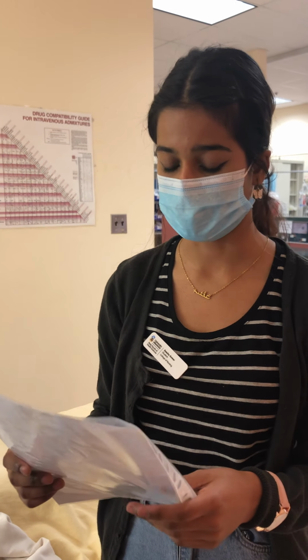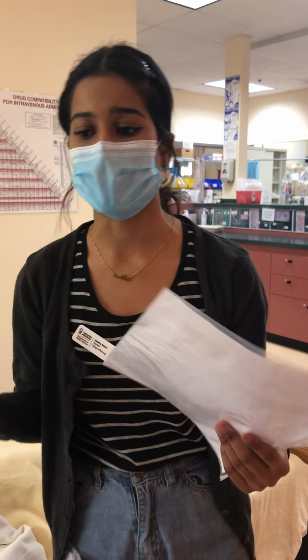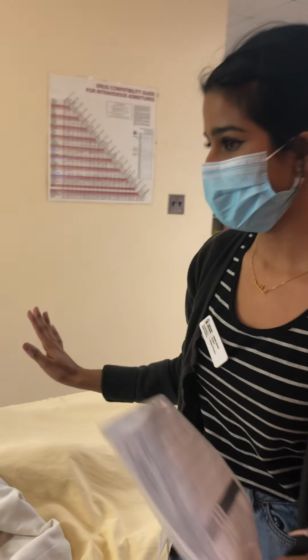So we'll be doing a two nurse check. So this is a 2 nurse check, so we'll be documenting a co-signer with that. So I'll make sure I do that in the MAR. So for now, we're good, we can leave.